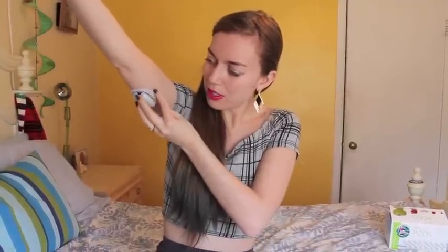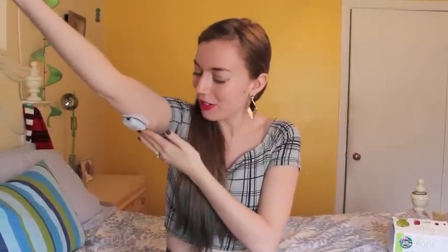I've found that being a girl who shaves her armpits, you want to make sure that you have a good space between the Omnipod and your armpit, so when you're shaving, you're not knocking it with your razor or anything like that. So this distance away is usually good for me. Make sure you smooth down all the edges.